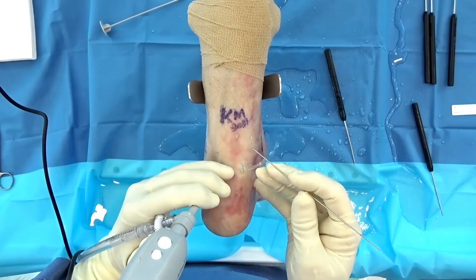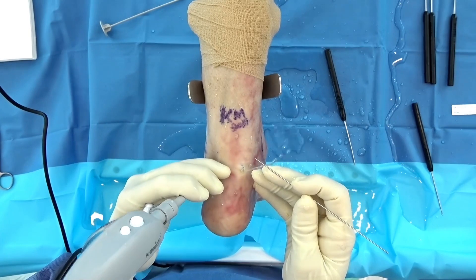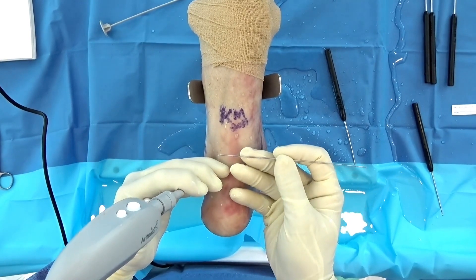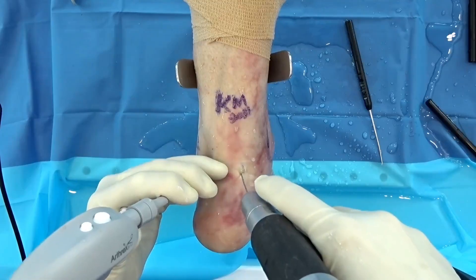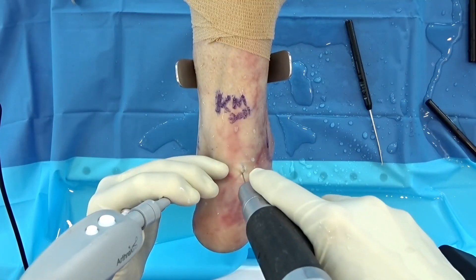Moving toward what I've been doing lately: treating talus fractures with arthroscopy is kind of a new thing, similar to in-office arthroscopy. When I have a talus body fracture — or even a neck fracture — if I get it reduced, I take the guide wire. This is a 1.1 millimeter guide wire from Arthrex's Comp FT system. I put the screw in through the back right through my portal, come right off the FHL, right off the articular margin — I'm looking at the cartilage. In real life we verify with fluoroscopy, of course. We'll take our ablator back and clean this up. This is also how I fix my posterior malleolus fractures.